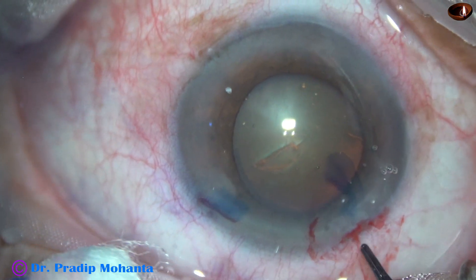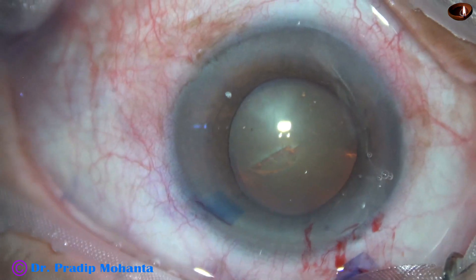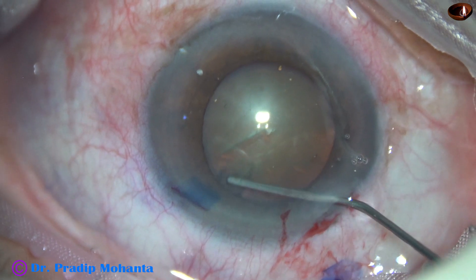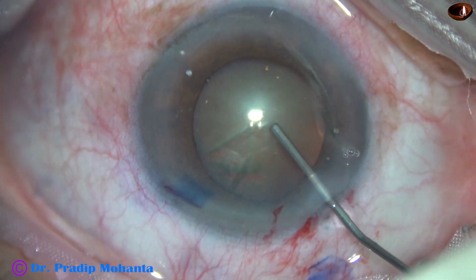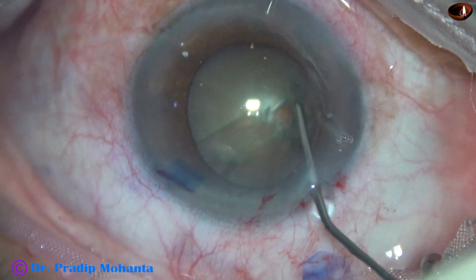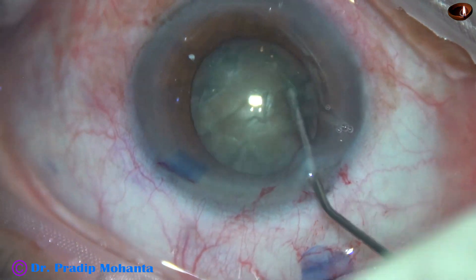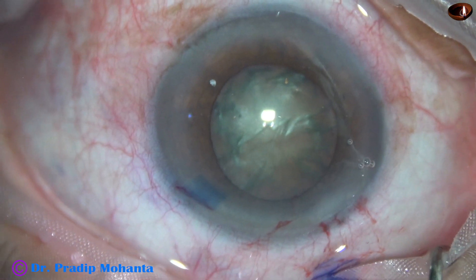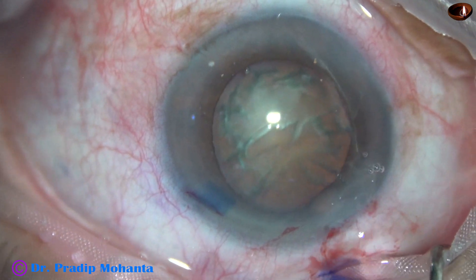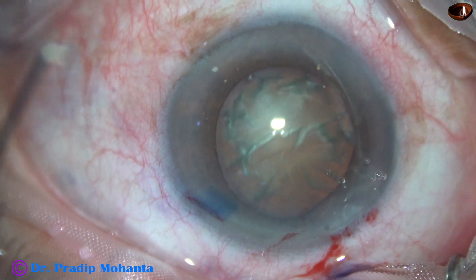And it is done. This is real time. Hydrodissection is very important. We should inject a small amount of fluid and watch the fluid wave. As it reaches the opposite equator, we should immediately stop. We should not inject too much fluid — if we do, there can be rupture of the posterior capsule, with fluid buildup behind the lens mass causing the posterior capsule to rip apart.